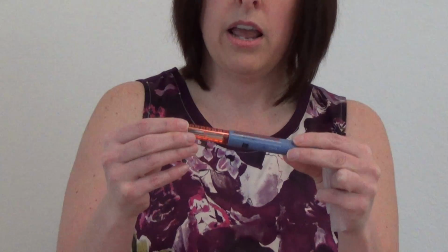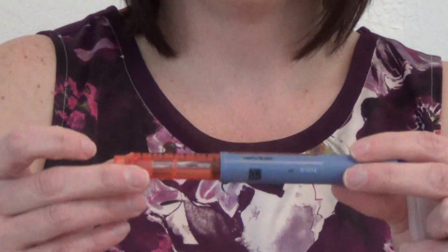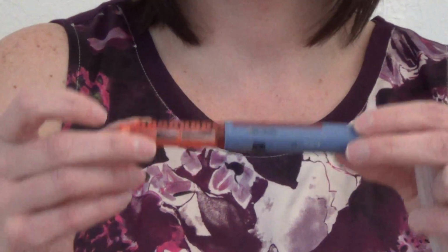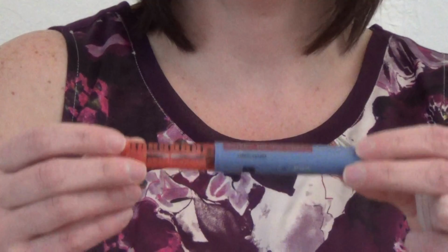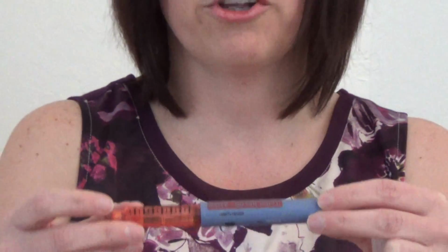You want to make sure that the insulin is clear, not cloudy, and does not have any particles in it. If it has any particles, you want to make sure you get rid of the pen. You can call the company to see if they would replace the pen for you, or return it to your local pharmacist to see if they can help you replace the pen.